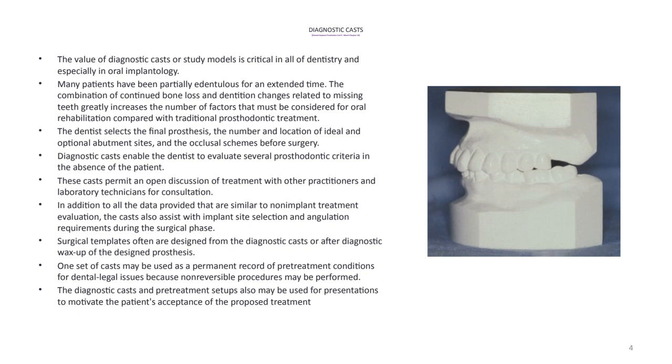The diagnostic cast and pre-treatment setup may also be used for presentation to motivate the patient's acceptance of the proposed treatment. So presenting the diagnostic cast and the diagnostic wax-up to the patient prior to establishing the treatment plan shows the patient how the final restoration is going to look, and it kind of puts them in that mindset to move on with the procedure.